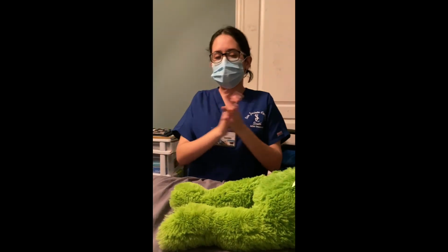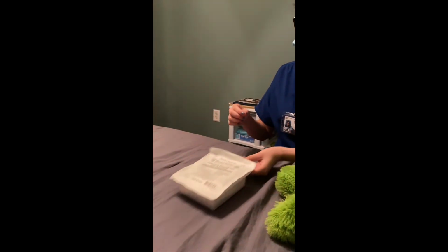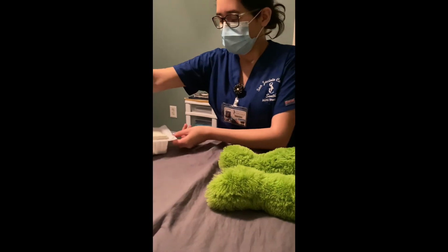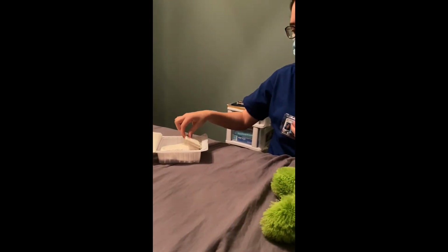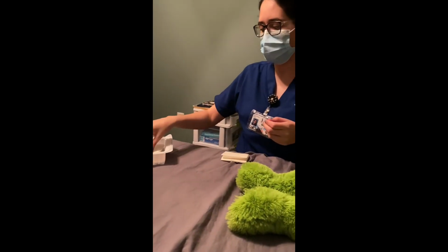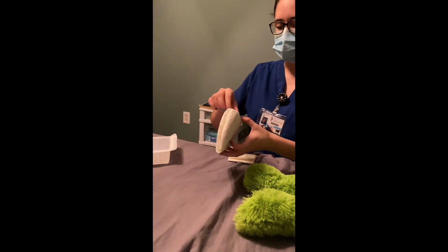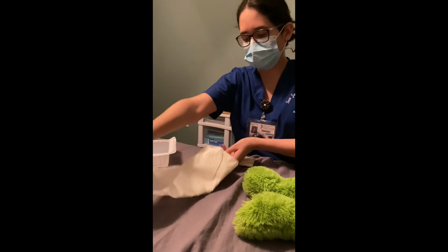And I'm going to open my sterile central line dressing tray. I'm going to open this away from me. I'm going to grab my gloves. And I'm going to open my, away from me.